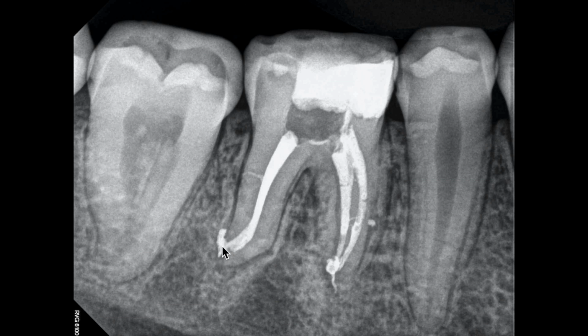You can see how open and where the apical periodontitis and the root terminus is, what was going on at that interface. And you can see this lateral accessory canal, this lateral canal coming off somewhere in that isthmus space of that distal root. And likely corresponding apical rarefaction represented on this X-ray, and likely apical periodontitis going on there. We also see a lot of interesting shapes here. The ball and the squiggly line out here, extrusion of some sealer from that down pack. Remember, I was giving this tooth a hickey.